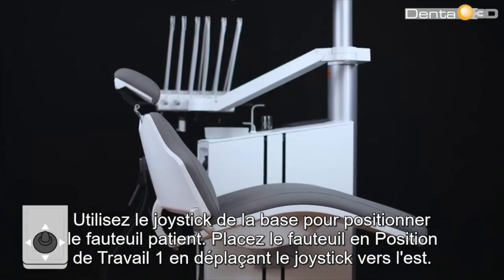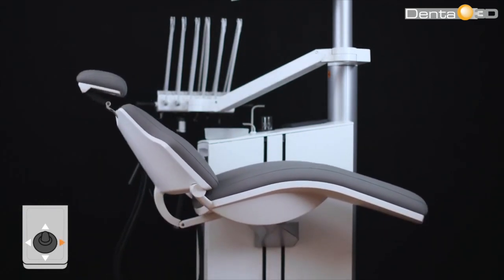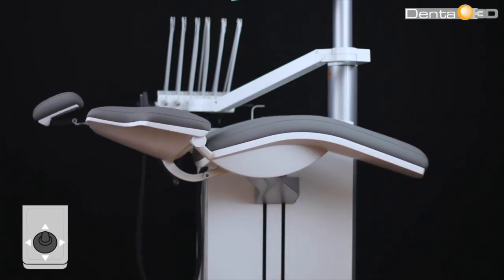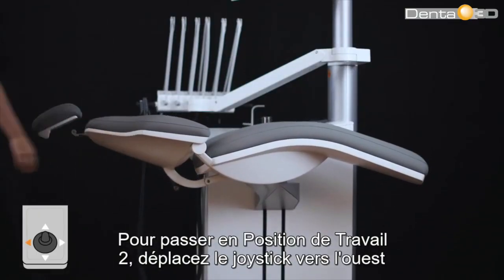Use the base joystick to position the patient chair. Position the chair in working position 1 by moving the joystick east. To reach working position 2, move the joystick west.